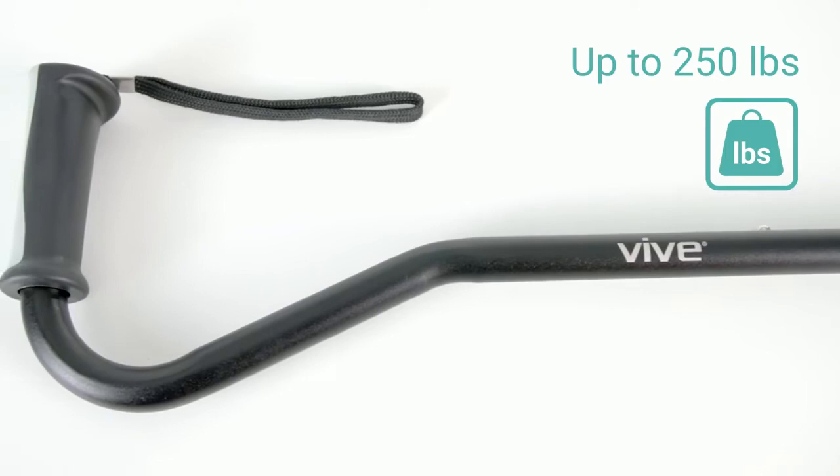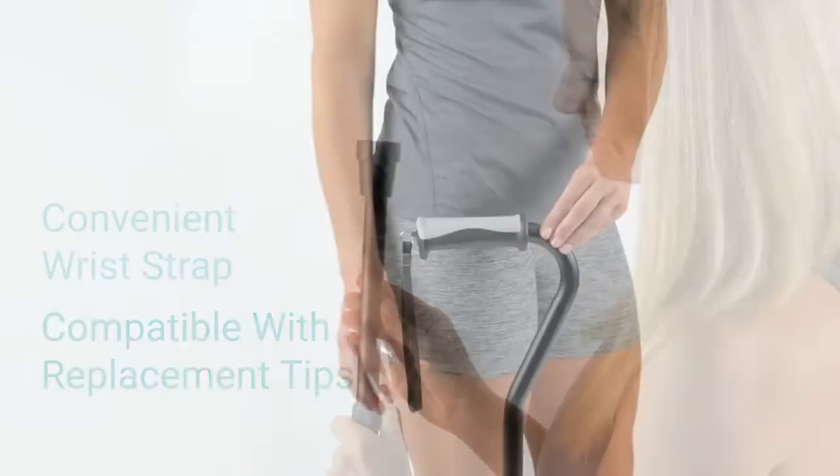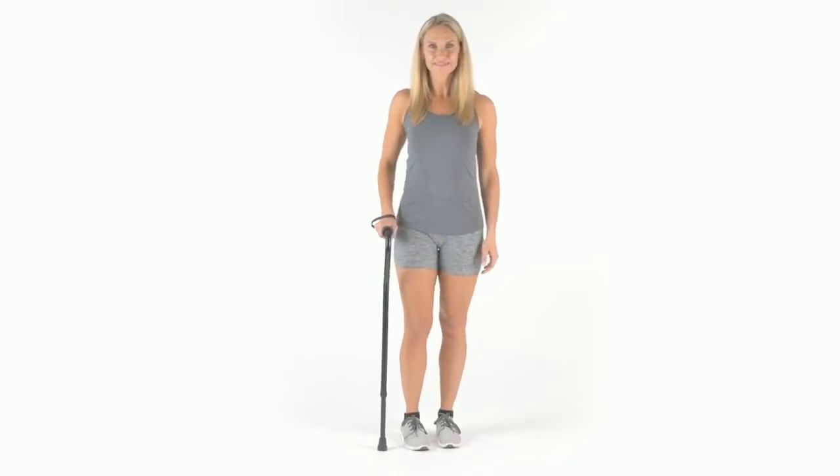Lightweight, corrosion-resistant anodized aluminum supports up to 250 pounds. The cane is capped with a slip-resistant rubber tip and is compatible with most replacement tips. The handle also includes a wrist strap for added convenience.